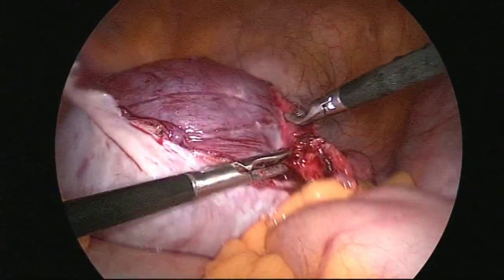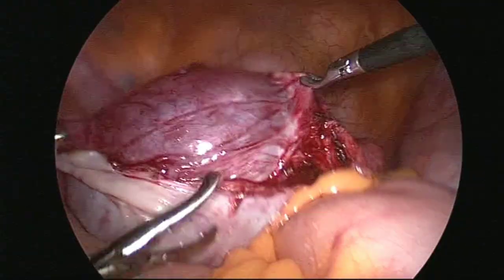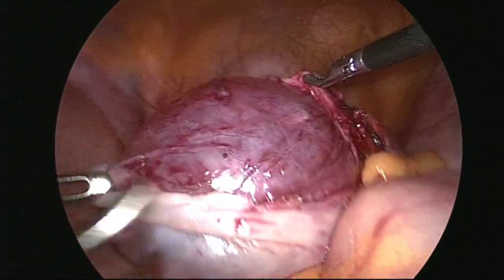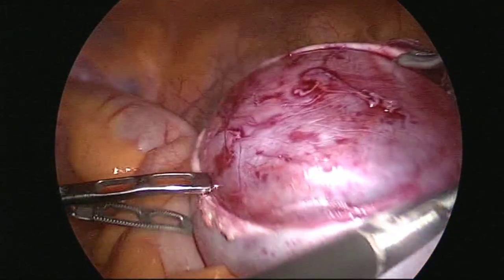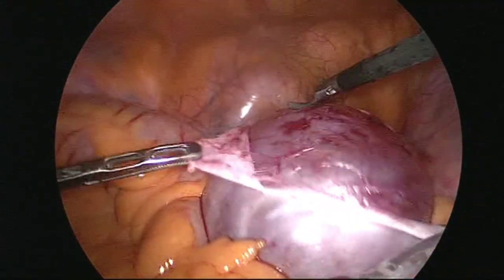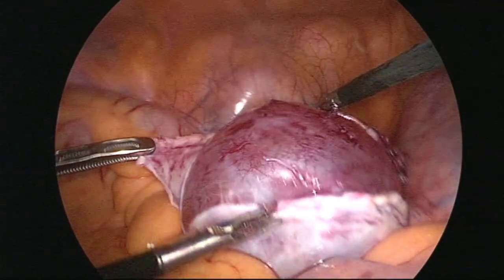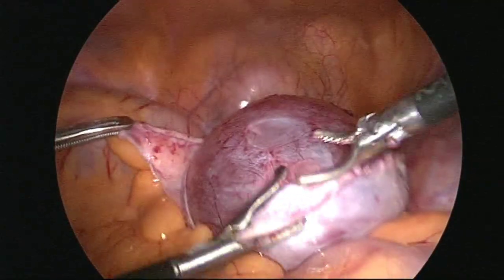And this is the healthy ovary tissue that I have to protect. Now for separation of this I have to show a lot of patience. Now I'm peeling off. Yes, now I'm able to separate it.